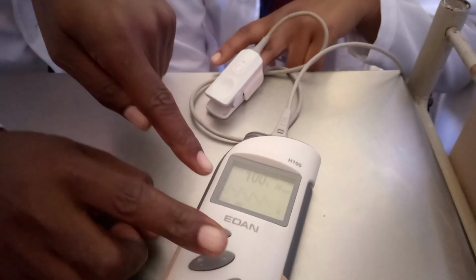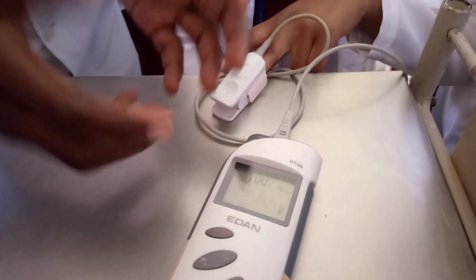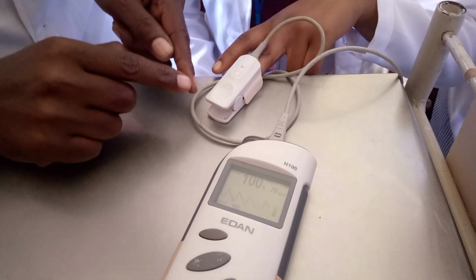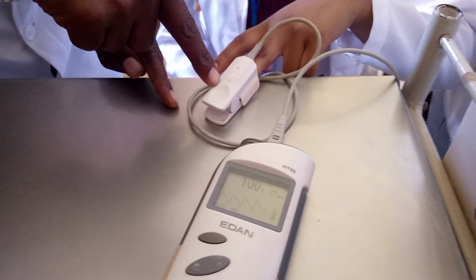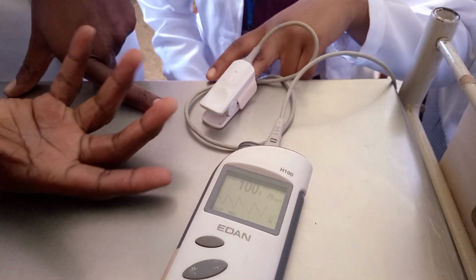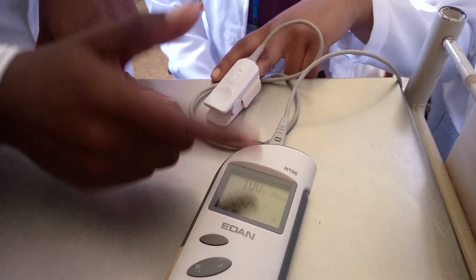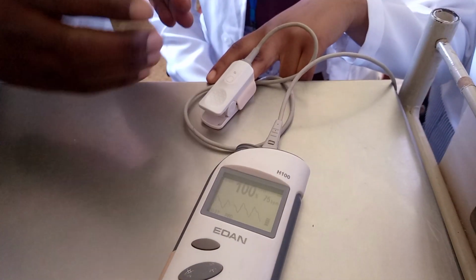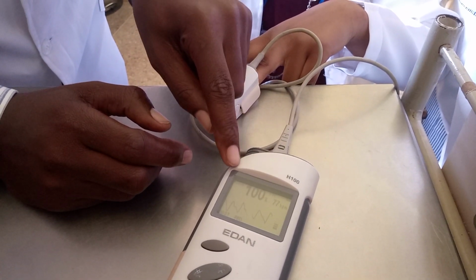This waveform shows you the intensity of light which is going through the tissues. As it goes through the tissues, it will find the arteries. Once it finds the arteries in the periphery, it's able to pick and show you the oxygen saturation, which is SpO2.